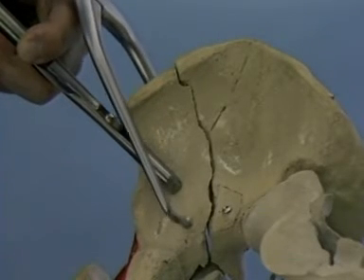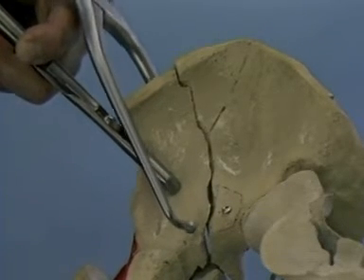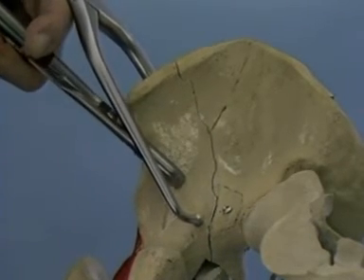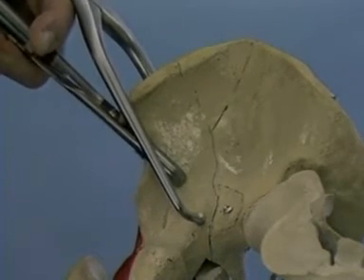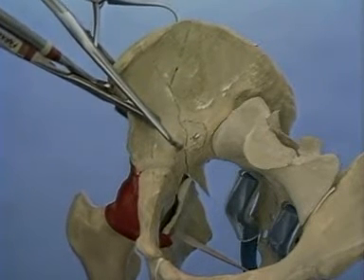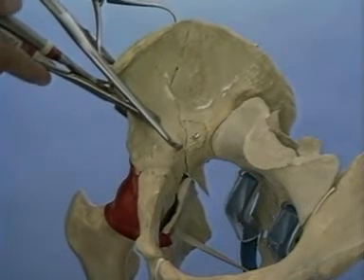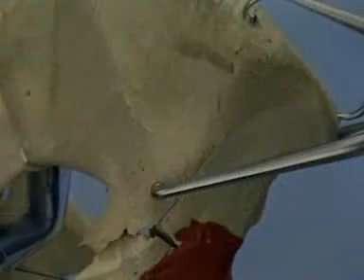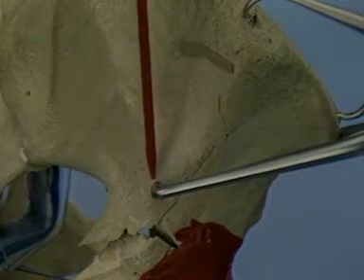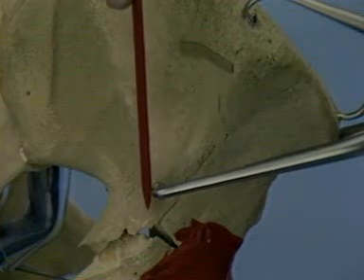It's often helpful to place the king tong on the inner and outer aspect of the bone to complete or hold the reduction. Pointed reduction forceps are used along the iliac crest. The king tong is seen on the outside of the bone with its tip on the intact ilium. The two points are positioned on different bone fragments because of the obliquity of the plane of the anterior column fracture.